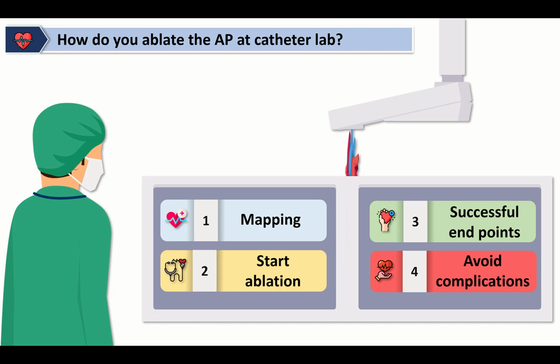Now let's go to the final part in our presentation today, the most challenging scenarios: accessory pathway. How to ablate the accessory pathway. Really, it was challenging in diagnosis, induction, and EP study, and now let's see how to ablate the accessory pathway.